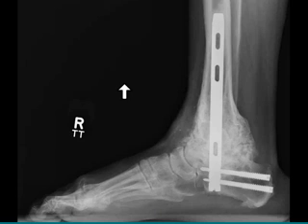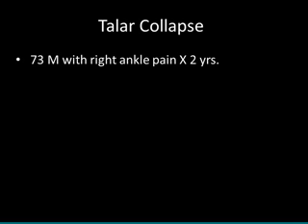Now, the nice thing about doing this is she's back to playing golf. She walks without a limp. I'm sure that leg gets more tired than the other leg when she goes out, but it really has restored her function, and I have a low threshold for doing that in these people and offering them that surgery. Now that's done straight posteriorly, and I always leave the fibula.